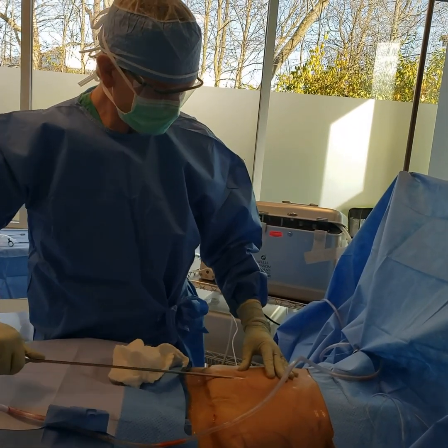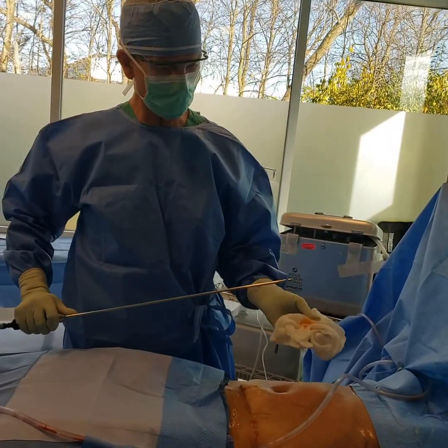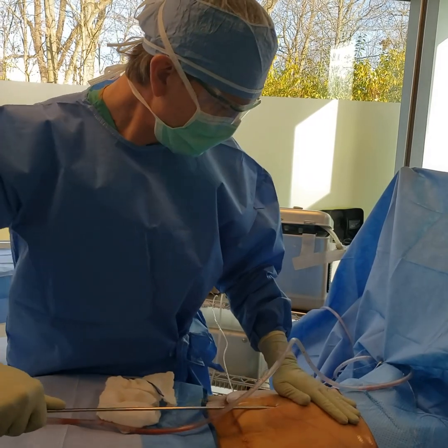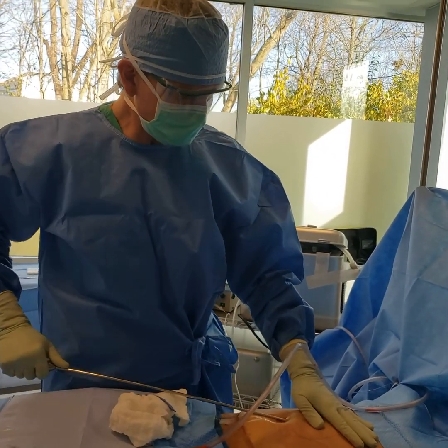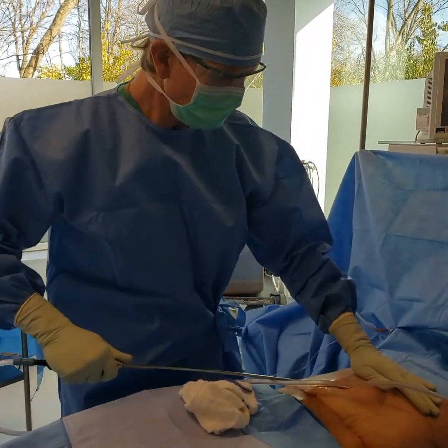So what we're going to do to start is break up all this scar tissue and break up the fat. And we're using this basket cannula here to do it. It's basically just knocking the fat up and breaking it away from the scar tissue. And it makes revising something like this, where she has so many irregular contours, easier. So we're just going to keep going to start till we get all the scar tissue broken up.